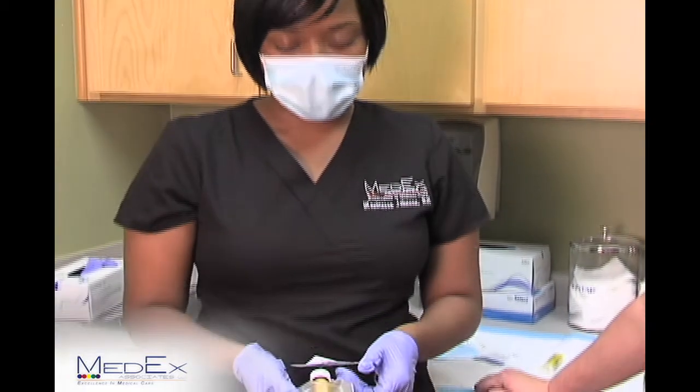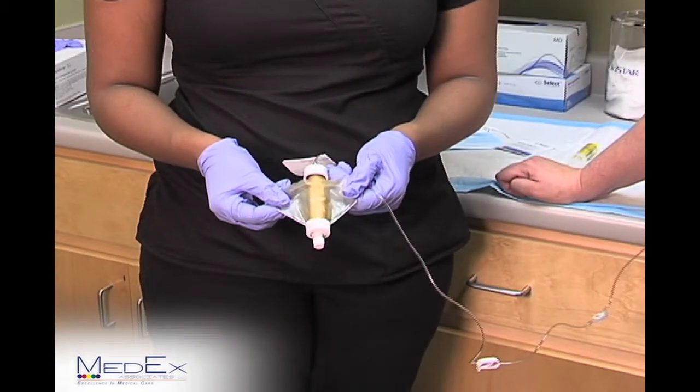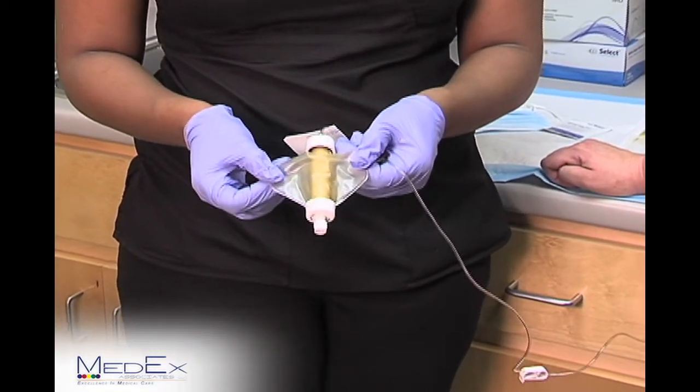Your infusion will take anywhere from 30 minutes to an hour depending on the dose of your antibiotic. Once your antibiotic is complete, your infusion pump will be completely empty.